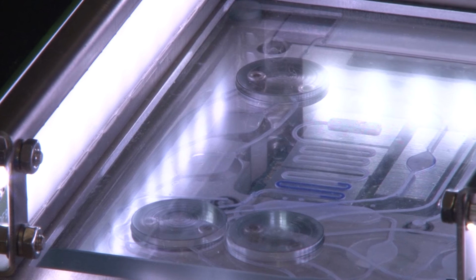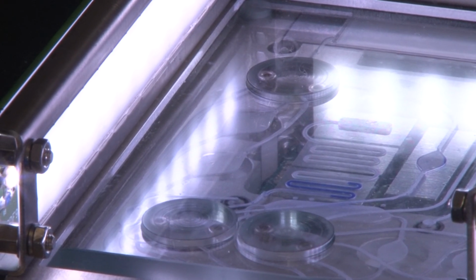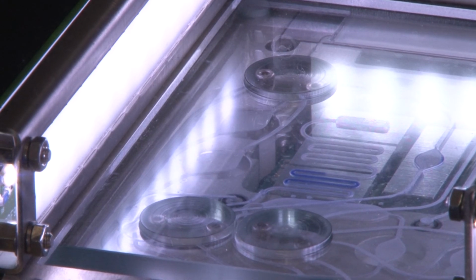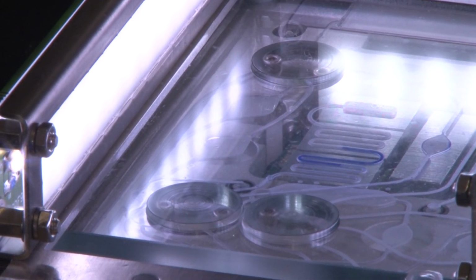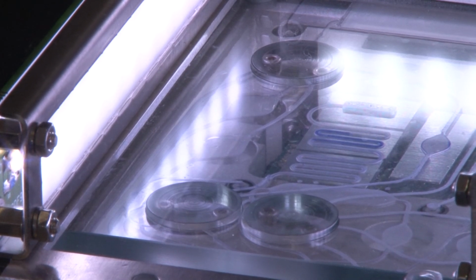So I just press play as before, and what it does is it moves the sample from one side, the cold side of the chip, to the hot side of the chip. The temperature here is about 60 to 62 degrees, and here 90 to 98.